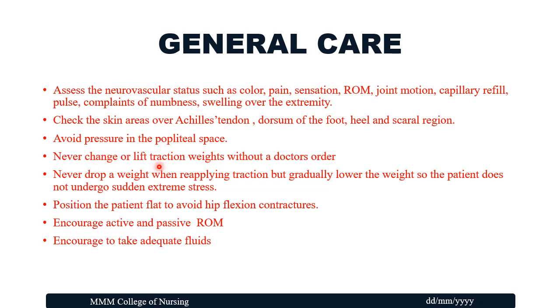Never change or lift traction weights without a doctor's order. Never drop a weight. When reapplying traction, gradually lower the weight so the patient does not undergo sudden extreme stress. Position the patient flat to avoid hip flexion contractures. Encourage active and passive range of motion exercises and encourage adequate fluid intake. So these are the general care.